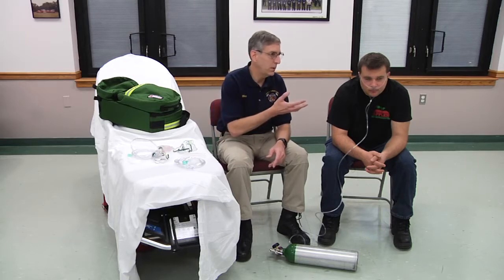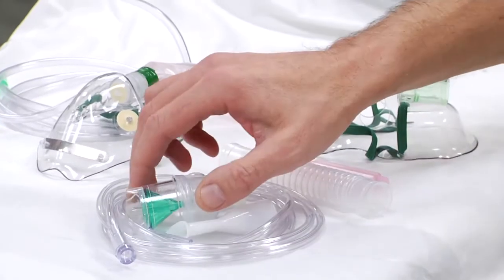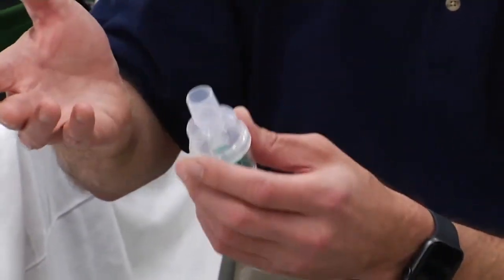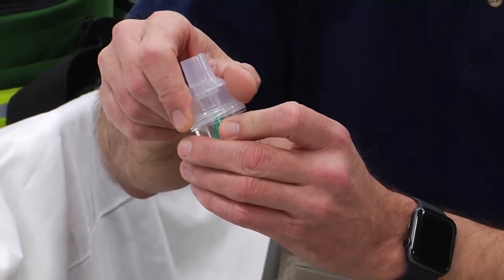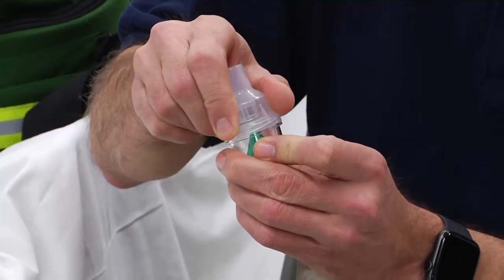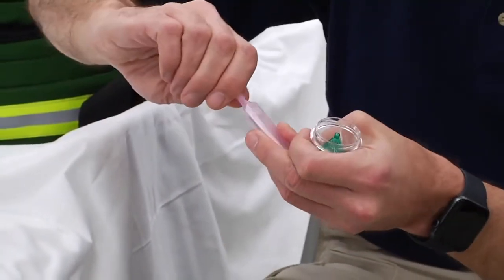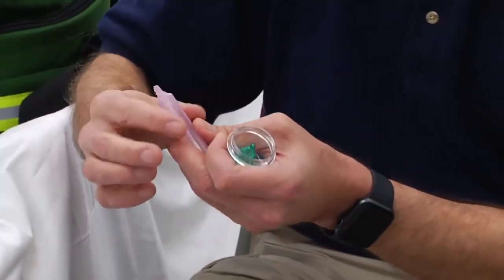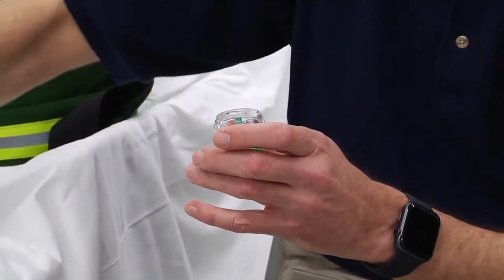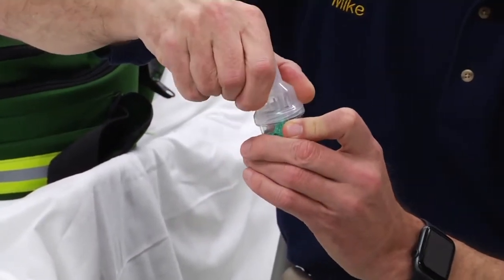We have our patient currently on some oxygen by nasal cannula. We're going to set up the small volume nebulizer. For training purposes, I'm going to put saline in the device today to illustrate some of the use of it. We'll take apart the nebulizer, squirt a little bit of the medication — in this case saline — into the nebulizer, and put the cap back on.